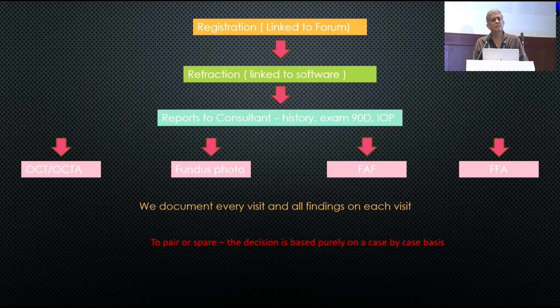We run a small but busy clinic within Delhi, and we first and foremost register the patient. All our registration is linked to Forum. Forum is a software provided by Zeiss and allows us that once the registration is done, each technician does not have to re-enter the data again and again into different machines, which is upsetting for both the patient as well as the technician. It takes up more and more time.